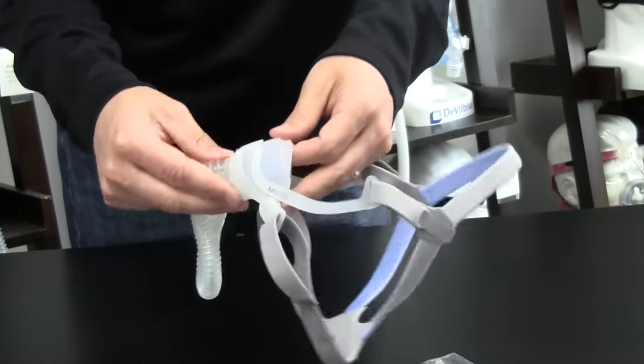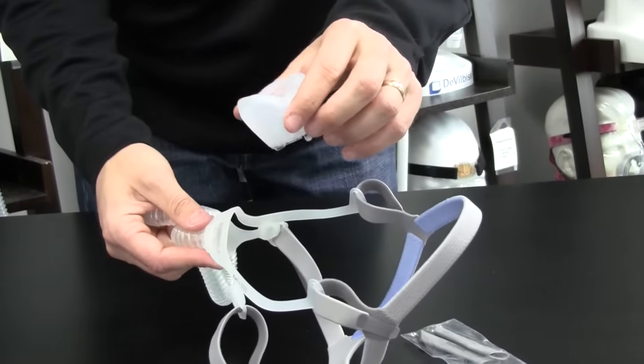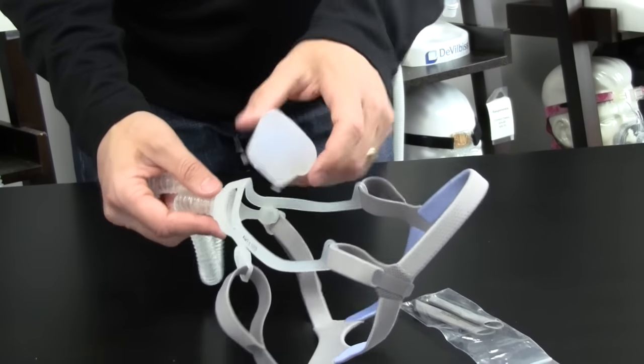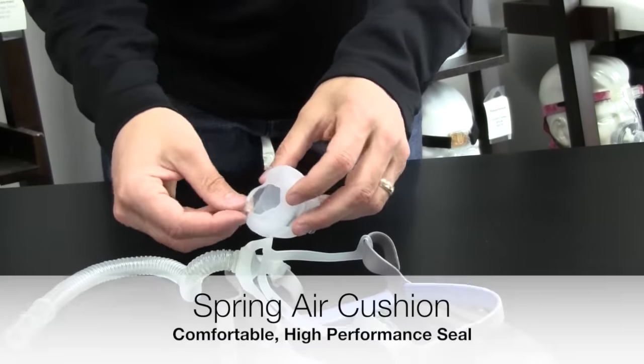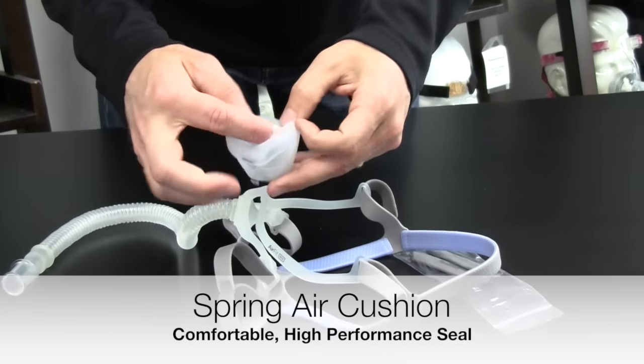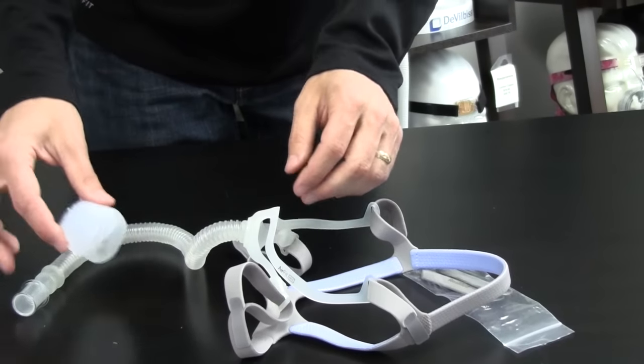The cushion is available in two different sizes. Easily replaceable, and you can take it apart very easily to clean. Just run some warm soapy water through here. It's their spring air cushion. It's got a little cushion on the outside and then another one inside. So when this inflates, it really does create a very good seal around your nose.